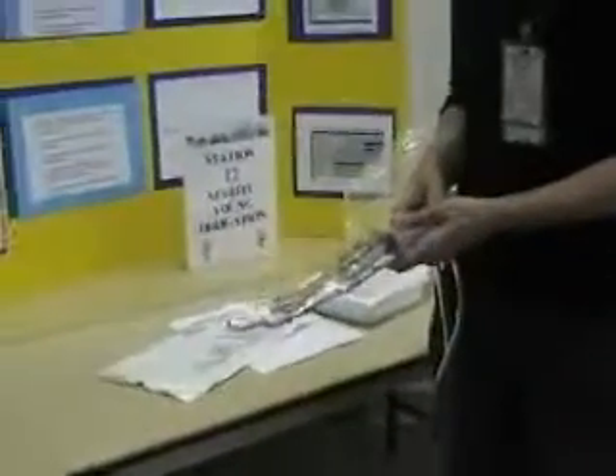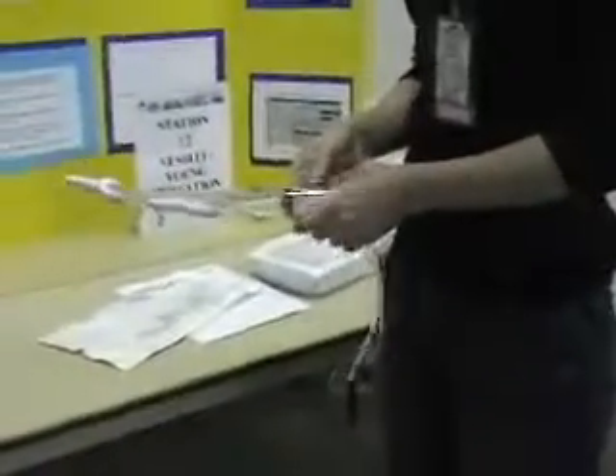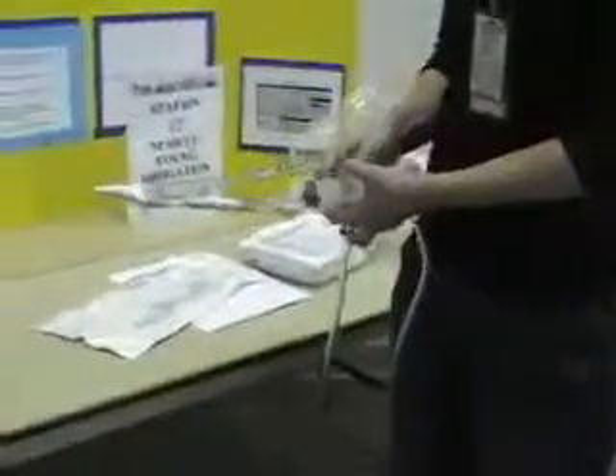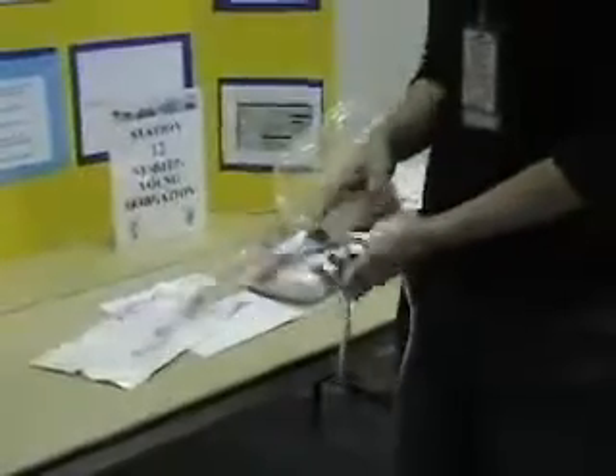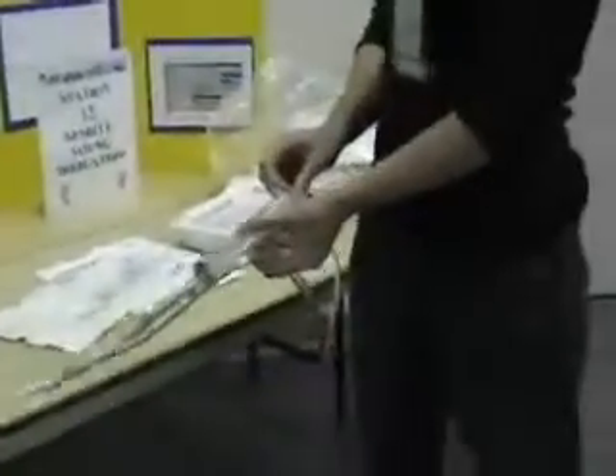You just have to know your tubing — the tubing going to the bag, the tubing going to gravity, and the tube going to the patient — and which one is clamped and which one is open. You have to be pretty good with your hands. When I clamp, I use my left hand. Your dominant hand is for the flushing — don't use your good hand for clamping.